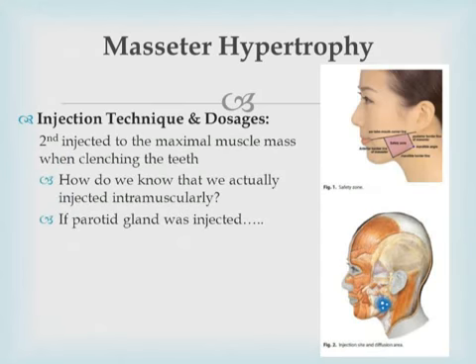And draw back, I may recommend, if you inject very deep, that you draw back a bit to see whether it is an intravascular injection or not. The second technique is usually used by dermatologists, who don't want to touch the bone because it's very painful. For me, I inject into the stiffer part. When you pass the needle at the beginning, it's loose, and then you feel a stiffness inside. I inject inside that, and it's a bit deep, like 1 inch.